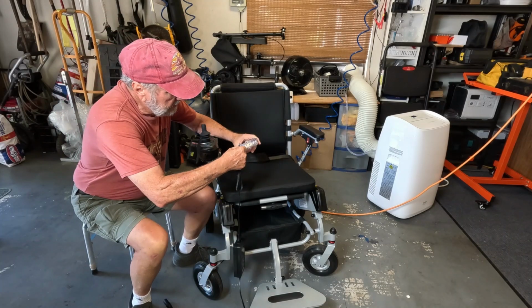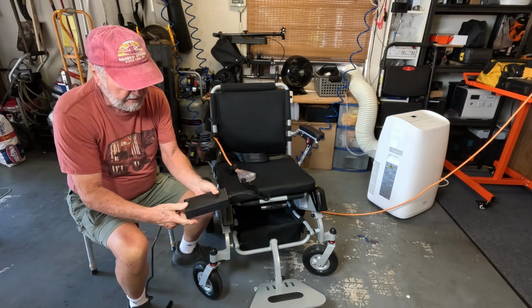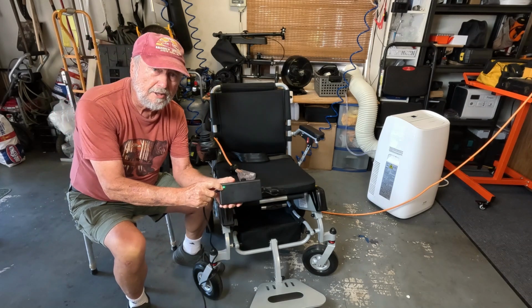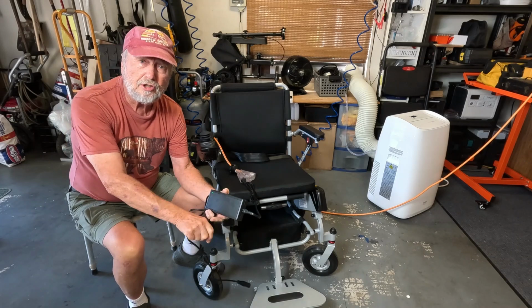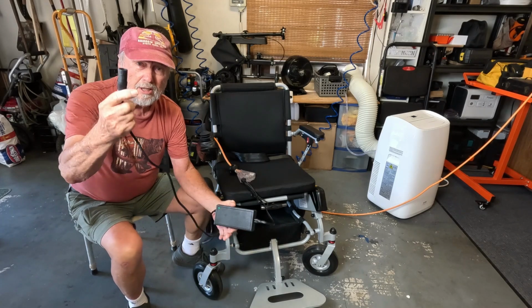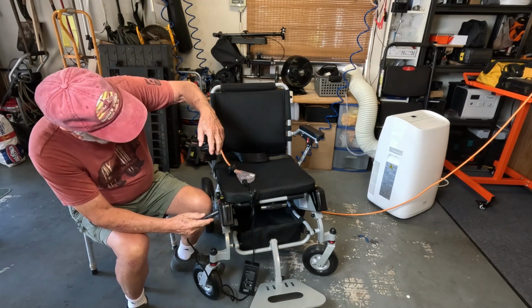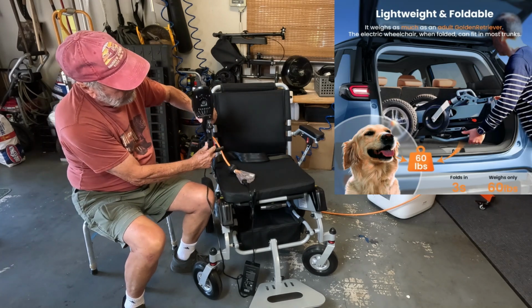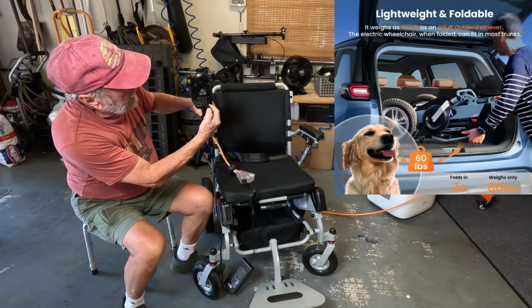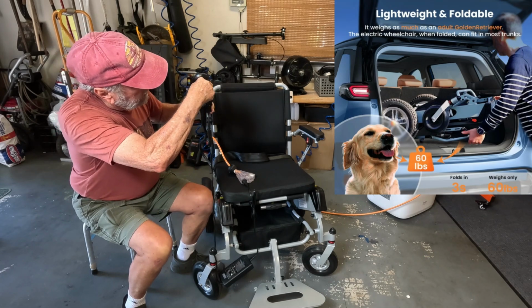Plug this into any AC outlet right there, and the other end, and there's a light on here that's going to tell you when it's charged. Green means that it's charged, but we don't have it plugged in. It'll always light up green until we get her plugged in, and you can just move this up if it's easier to see. And then this only goes one way, and it won't go in until it gets right.